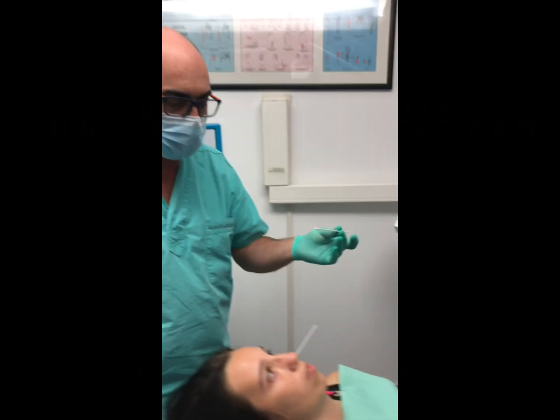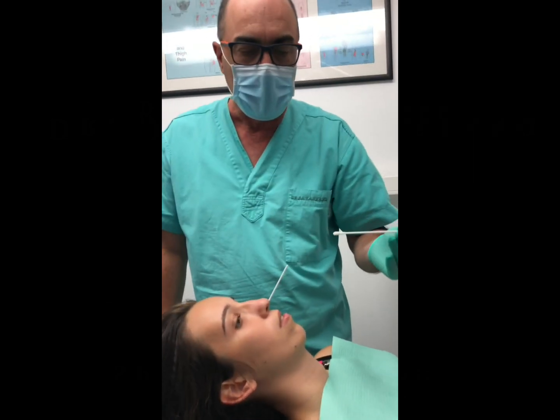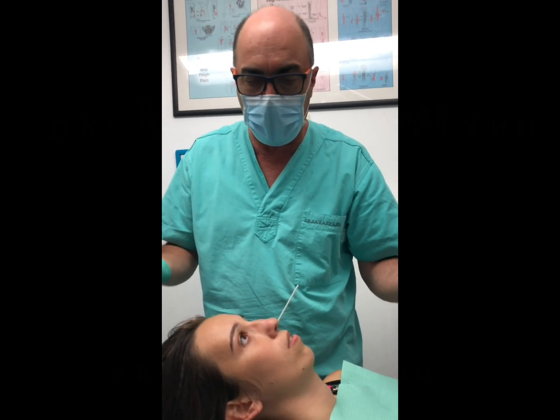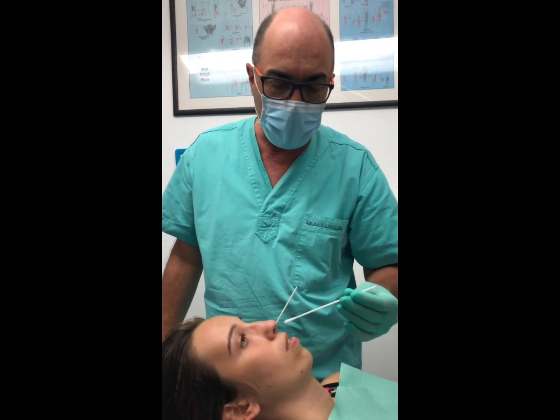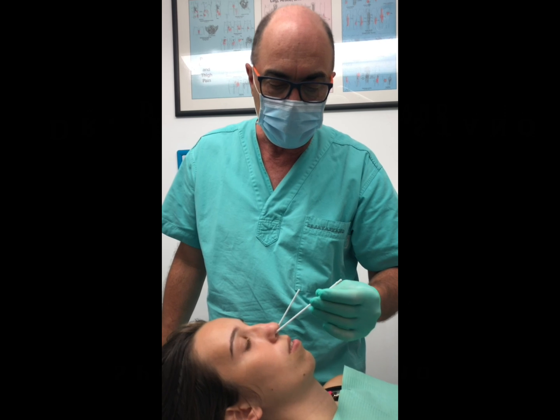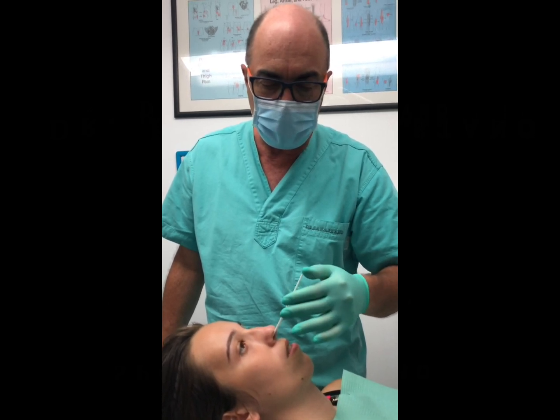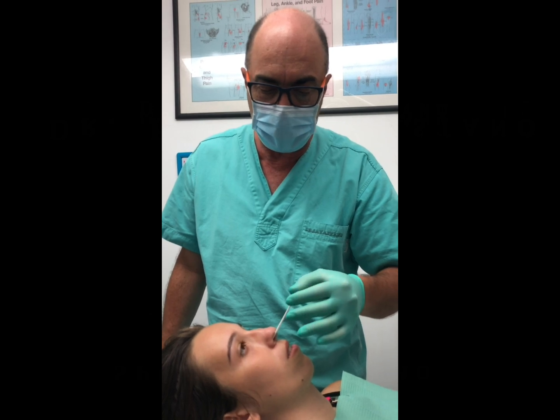Now this is the insertion. Insertion is very easy. Some patients you might have it a little bit more difficult, so you won't go all the way down, but we want to go all the way down — just like that, 90 degrees — and that's done.